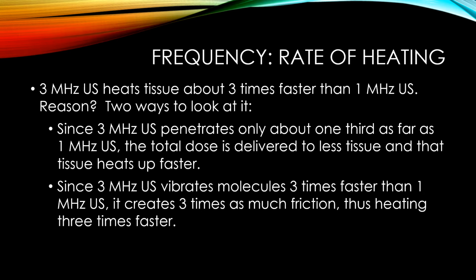One thing you will often find in textbooks or articles is recommendations for intensity or duration, and those recommendations won't include frequency, which is a critical component in determining how much energy is occurring.